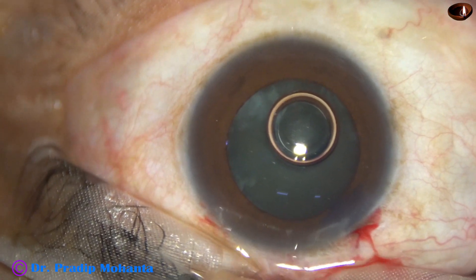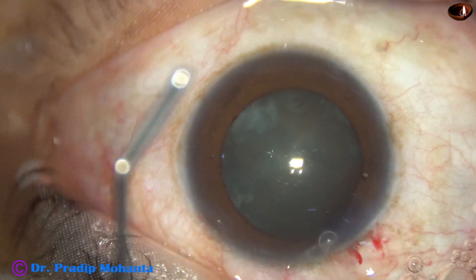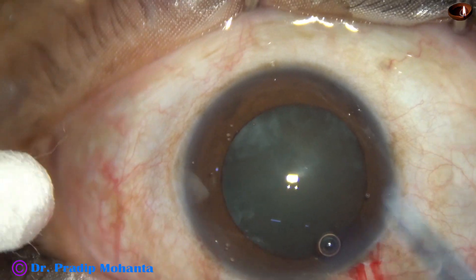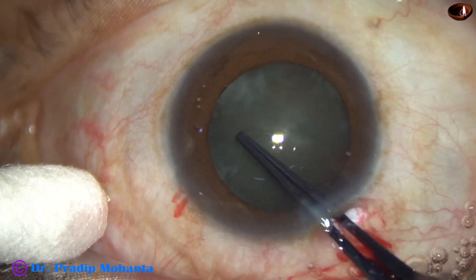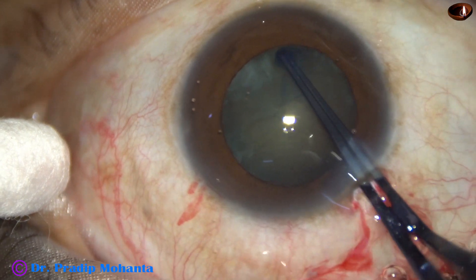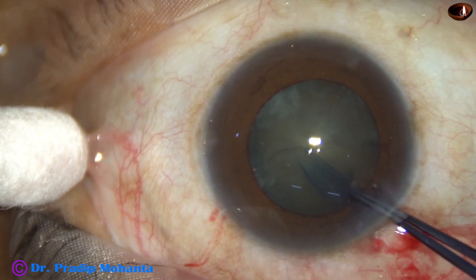Now the anterior chamber is filled up with viscoelastic substance — this is 2% hydroxypropyl methylcellulose — and it is applied over the ocular surface and over the cornea for better visibility. Now this is the utrata forceps. Capsular exercise — capsulorhexis — is being done with this instrument. I usually go anti-clockwise, raising a capsular tag; some colleagues may go clockwise, whatever is comfortable for them.